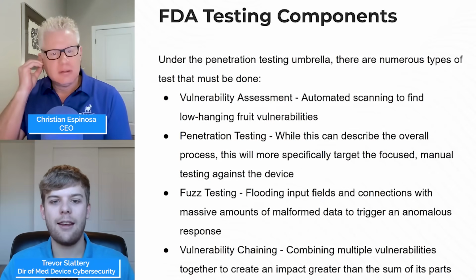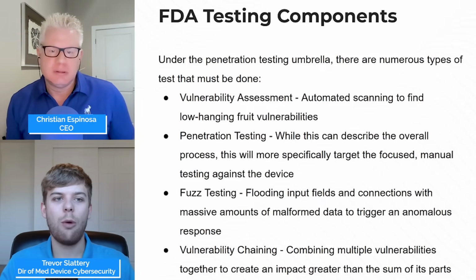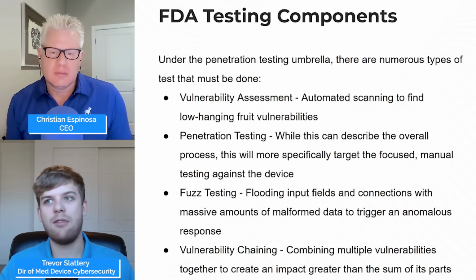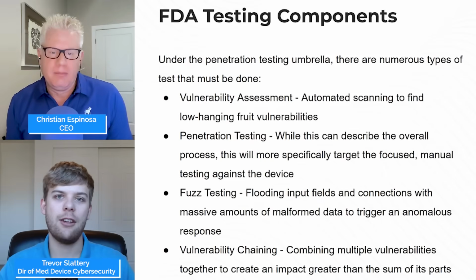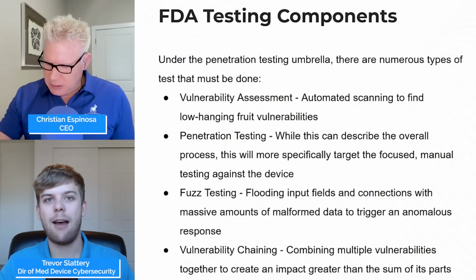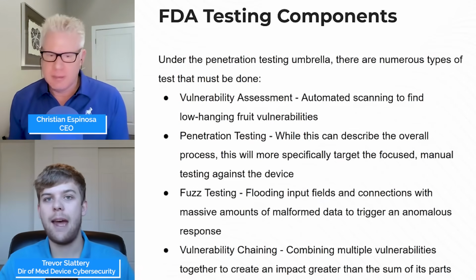The next thing that we look at is fuzz testing. Fuzz testing is something required by the FDA. And what it can essentially be thought of is throwing a massive amount of junk data at different input fields or different connections to see if it'll respond in a strange way. This can be just sending different length strings starting from 1 up to 100,000 into a single input field and see if it eventually crashes to indicate there's a memory problem. Or sending malformed data into a certain interface to see if the application responds in a weird way or doesn't respond at all, or if it even ingests the bad data.